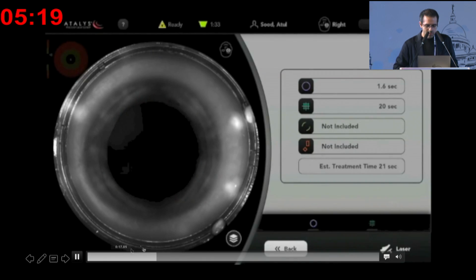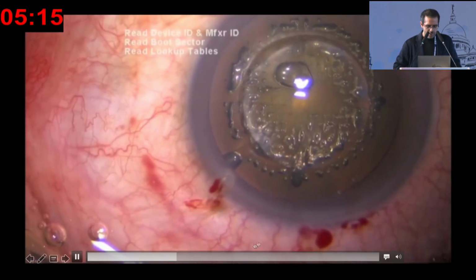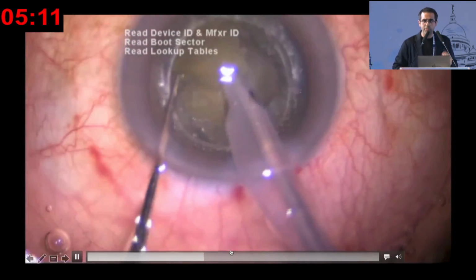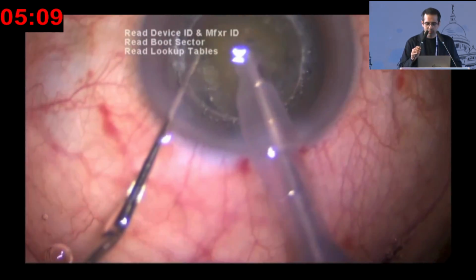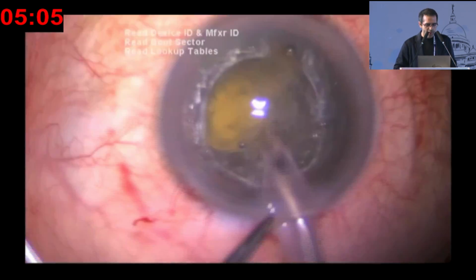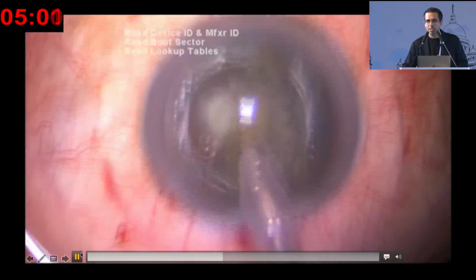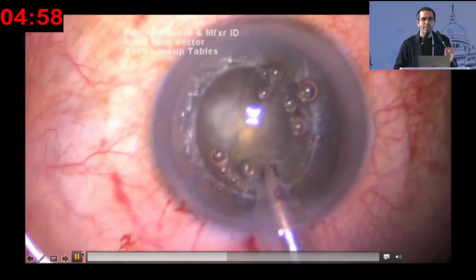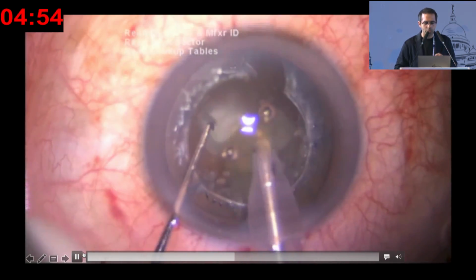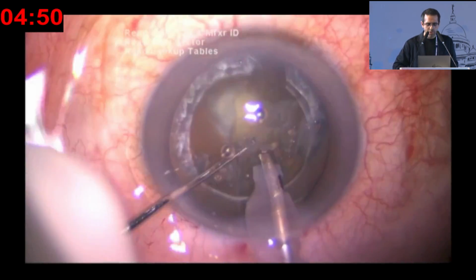Once the laser fires, this is the intraoperative image. As a normal cataract surgery will proceed, we try and do a closed chamber phacoemulsification with low fluidics. Once the nucleus is removed, again, we try not to do any hydro procedures. If at all you have to, maybe hydrodelineation, but no dissection whatsoever. But with a femto laser, what we are trying to do is no hydro procedure at all. Because of the thick epinuclear cushion, we are going to protect our posterior capsule.